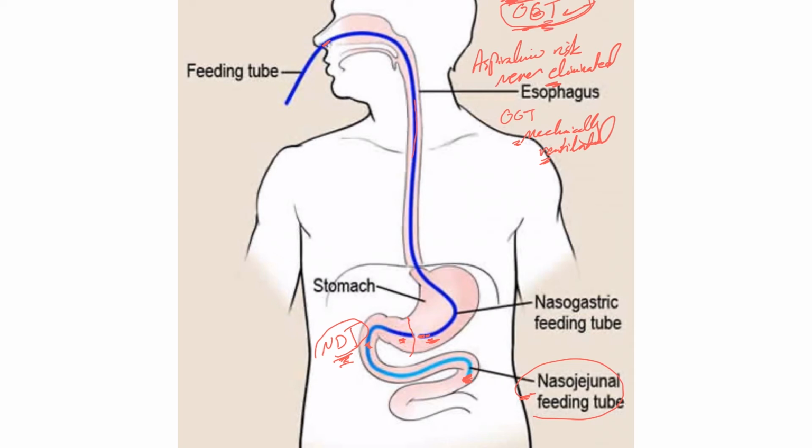Technically in sedated, so NG tube or OG tube, but technically it's easier to put an OG tube. That's why in our ICU most of the intubated patients on sedation have an OG tube, because it's easier to place and the patient is sedated.